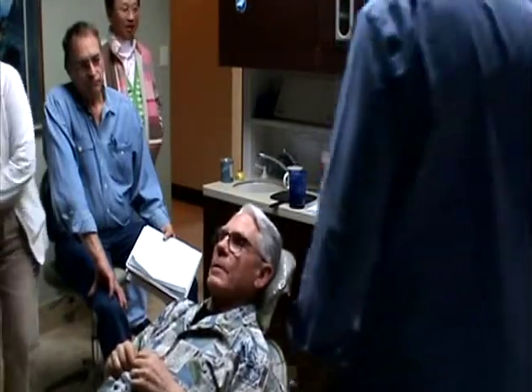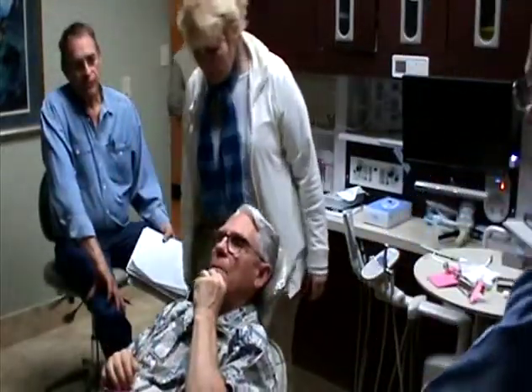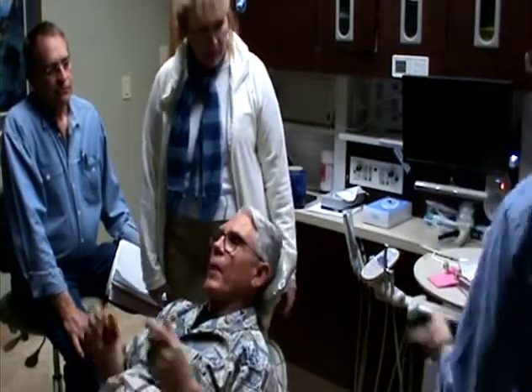Well, now we got the burr, let's grind on it. Right there. I can tell you where it is. You want me to? We could mark it, we don't have to grind on it. It would be so slight, you would just take the color off. That's how slight it would be. It's right there. I'll be happy to. After that, test.